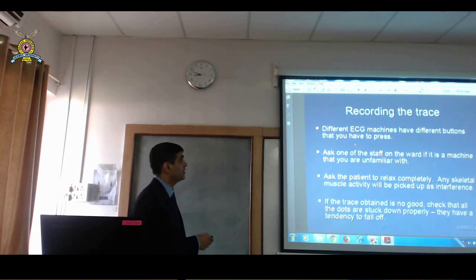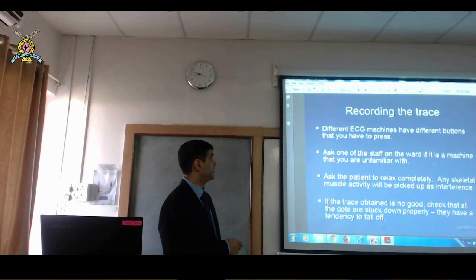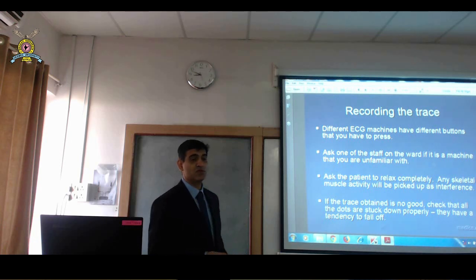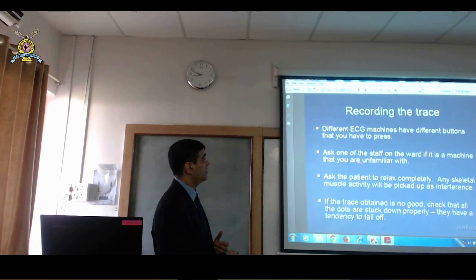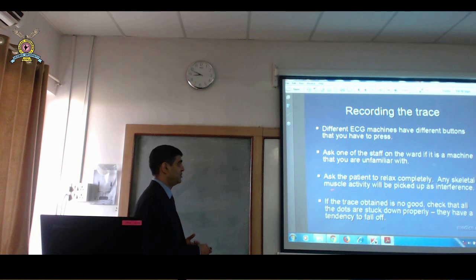So now another thing is every company has got some variation in software and technology and buttons they make. And everybody wants to make it friendly to the doctor and the patient. Okay? So machines are different, so there's no reason to think that you are an expert in every machine. If you are new to the hospital or new clinic, ask the nurse who is doing ECG every day. So she will have better knowledge of that machine than you would have. Every machine is different, and ask one of the staff on the ward if it's a machine that you are unfamiliar with. Okay? So if your machine is there, you should be completely familiar with the machine.